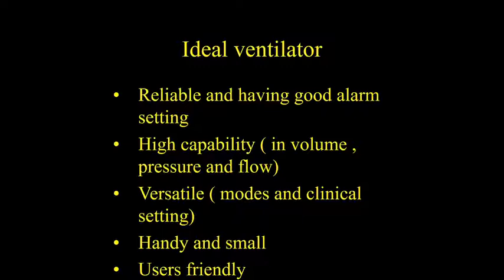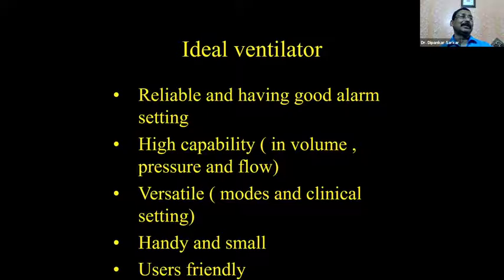High capability, that is in volume, pressure, and flow, so you can maneuver within this volume, pressure, and flow. Versatile, there will be different modes. Handy and small, it should be portable, that ventilators are taken here.